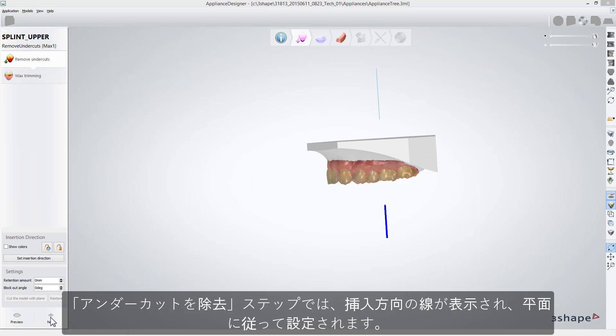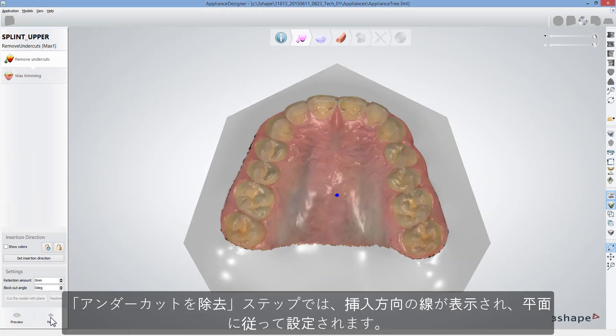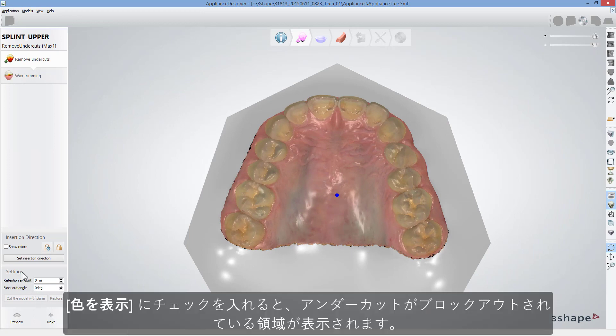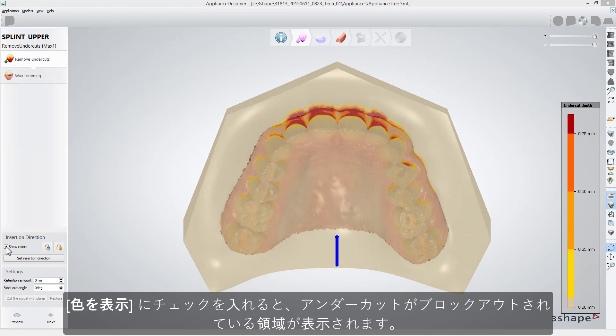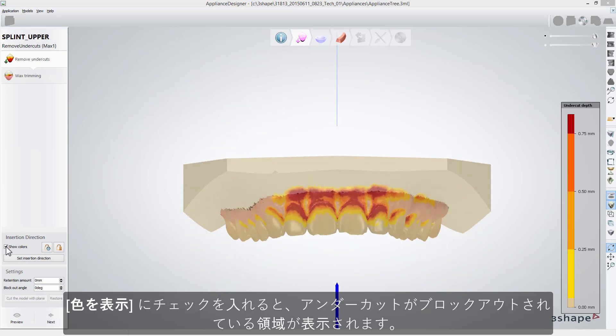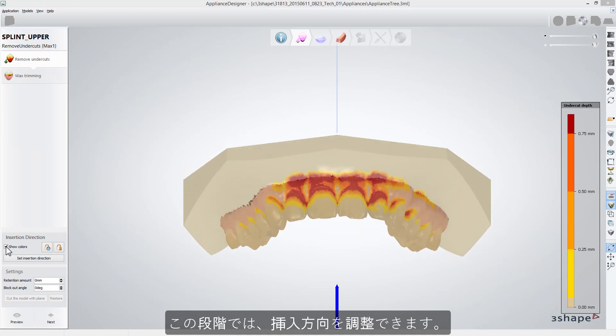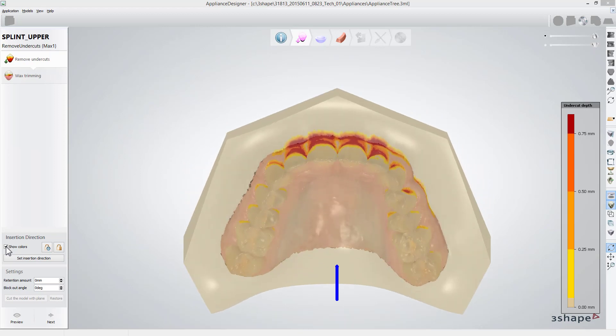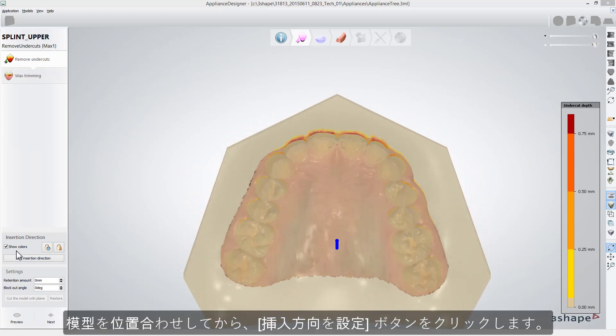In the Remove Undercuts step, the insertion direction line will appear and will be set according to the plane. If you select the Show Colors box, you will visualize the undercuts blocking areas. At this stage, you can adjust the insertion direction. Just adjust the model's position and click the Set Insertion Direction button.